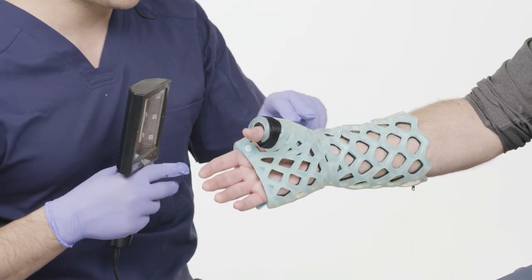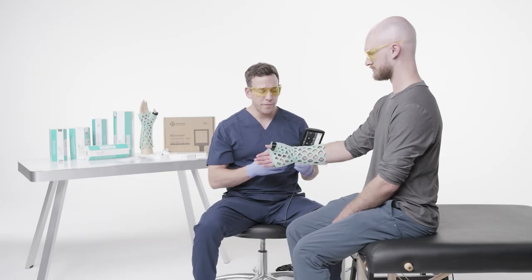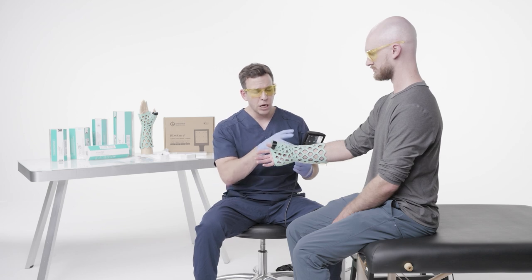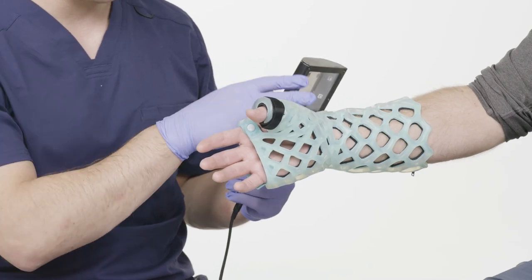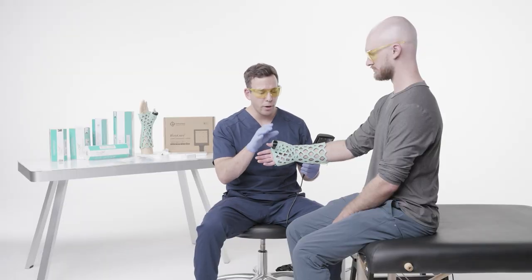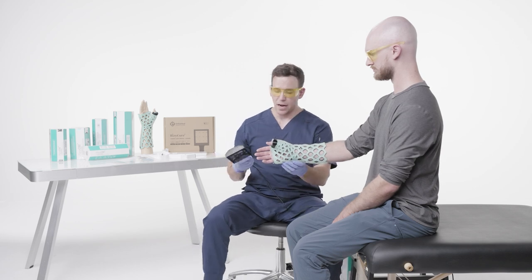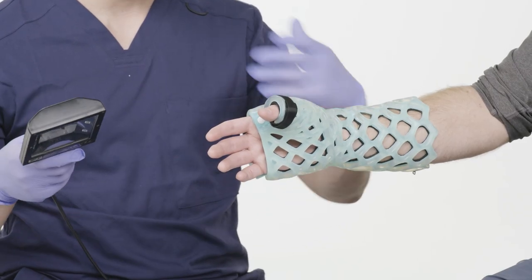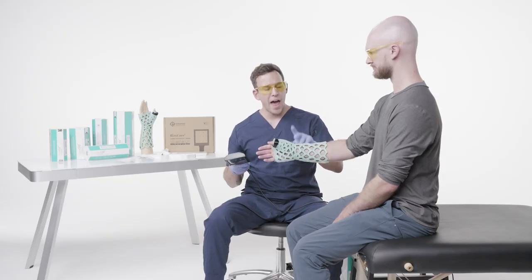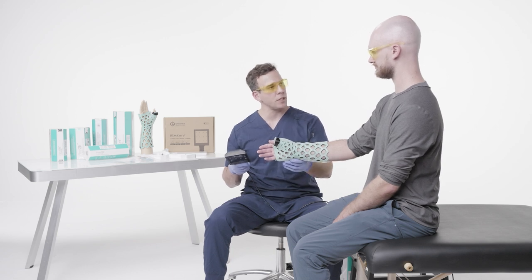I always want to make sure I'm doing the injured area first. We have a thumb spica applied, so there's some thumb issue — whether it's the scaphoid, the carpometacarpal joint, the trapezium, a thumb sprain, or anything where you want to immobilize the joint so it can't flex, extend, abduct, or adduct. I'm going to turn this on and every couple of seconds it will beep — that beep tells me that area has been cured and I can move to a different area of the wrist.